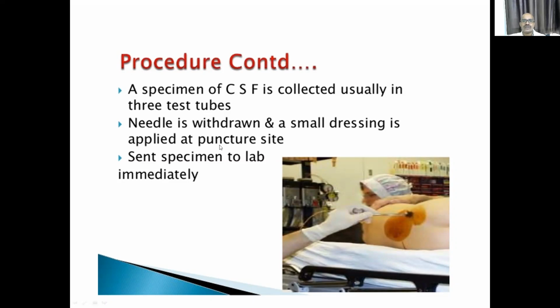The needle is withdrawn, a small dressing is applied at the puncture site, and the specimen is sent to the laboratory. Of these 3 tubes, 1 tube is sent to biochemistry for CSF glucose and protein. One tube is sent to microbiology for culture sensitivity and Gram stain.